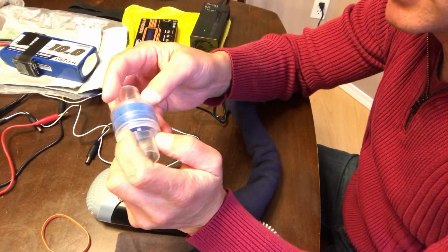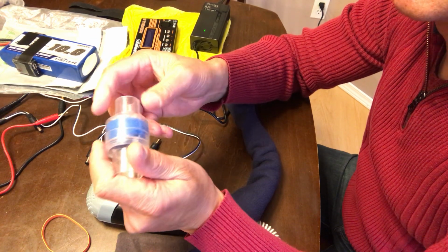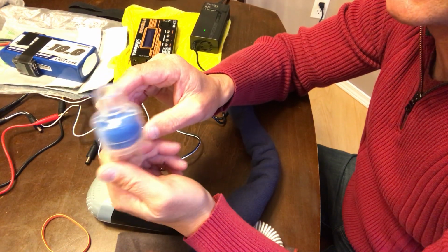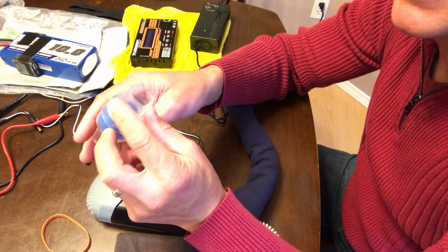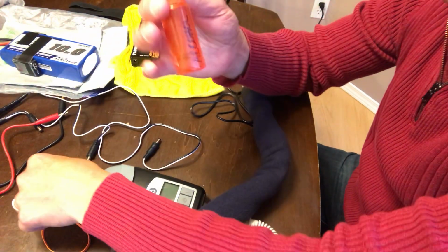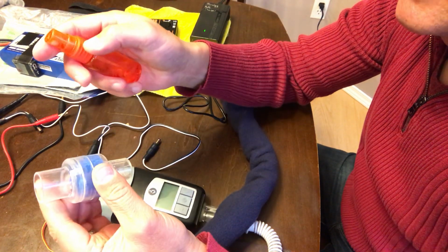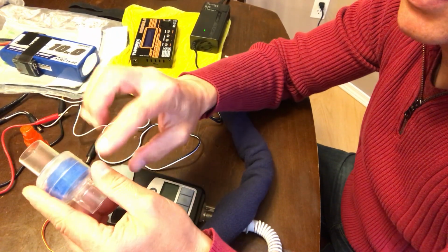And then also it's worth noting, I bought this HME. This is a humidity moisture exchanger. I think that's what it's called. Anyway, this little unit, they say is not serviceable, and they want you to throw these away and buy a pack of 30. I used it for a month, no problem. And how I did it was, after each use, I would put it under the faucet and rinse with water. And then I just took a little bit of regular isopropyl rubbing alcohol, and I would spray that in, 2 here, 2 or 3 here, and then take a tiny bit of water, pour it in, and just slosh it around so the alcohol would mix inside.